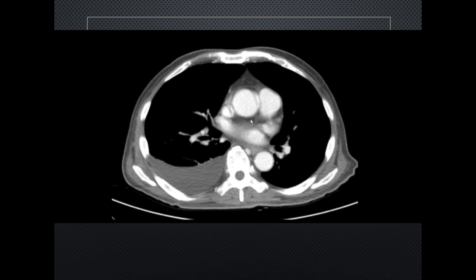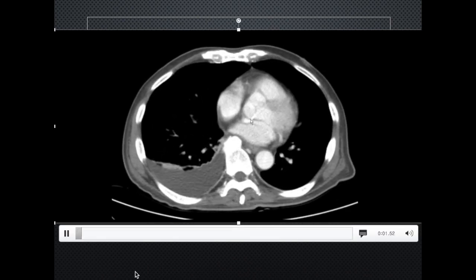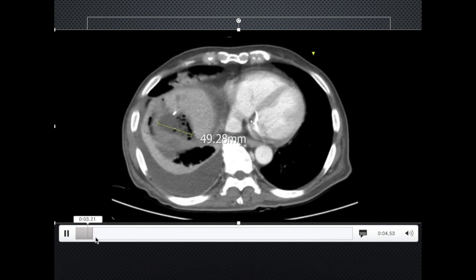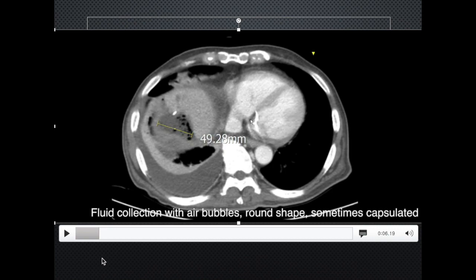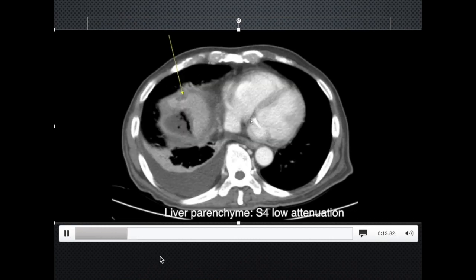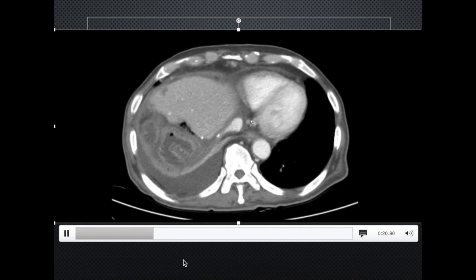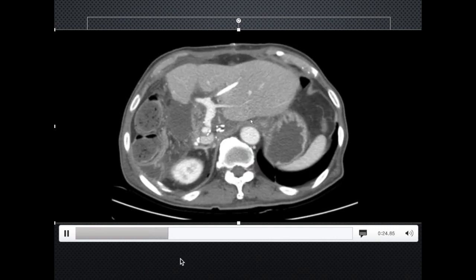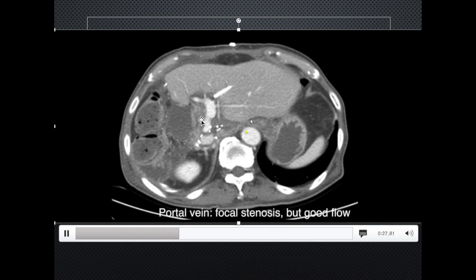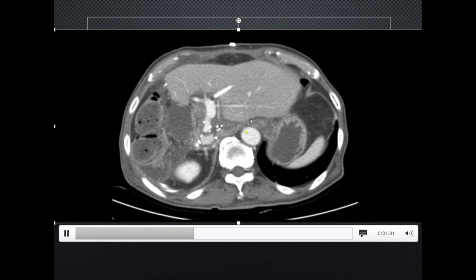Here is an example of a patient who underwent right hemihepatectomy with CT taken on the fourth postoperative day. There is a right-sided pleural effusion, which is most probably reactive. At the operation site, there is fluid collection with air bubbles, about 5 cm in length, with a quite round shape. Sometimes complicated fluid collections like these have a capsule that is enhanced. There is low attenuation in the liver parenchyma — we have to differentiate whether it's a tumor or some kind of focal infarction, and it seems like the latter. The left portal vein is checked and there is a focal stenosis in this area, but the overall flow is good, extending to the distal areas of the parenchyma. The hepatic vein seems patent.